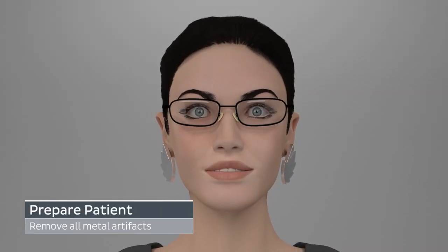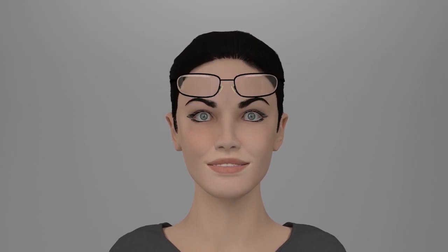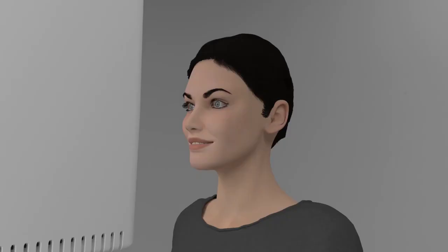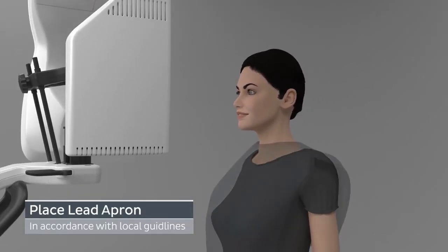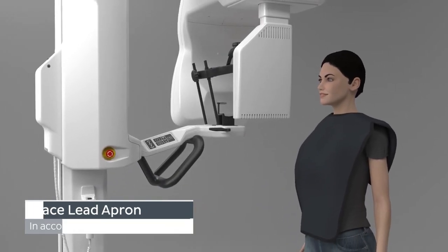Prepare the patient for the procedure by asking the patient to remove any metal artifacts including earrings, necklaces, hairpins, or removable appliances from the shoulders and above. Properly place the protective lead apron over the patient in accordance with local regulations.